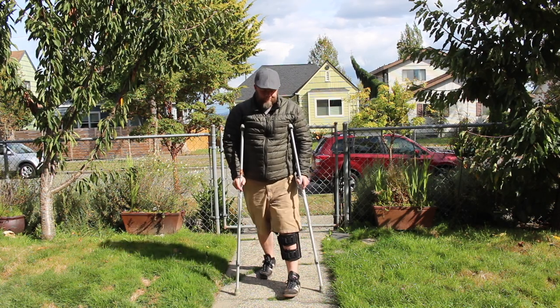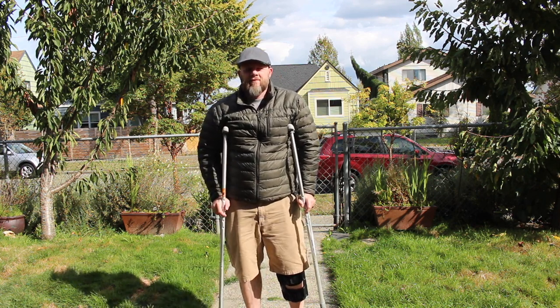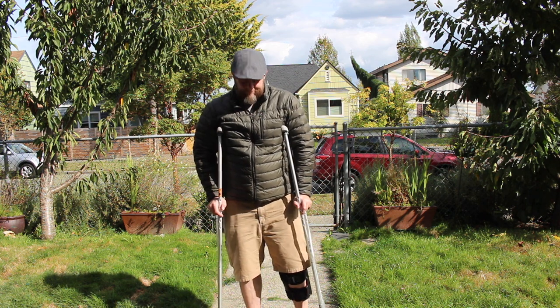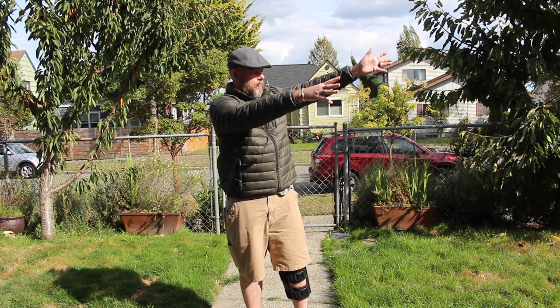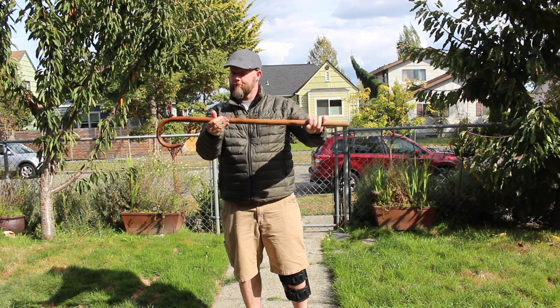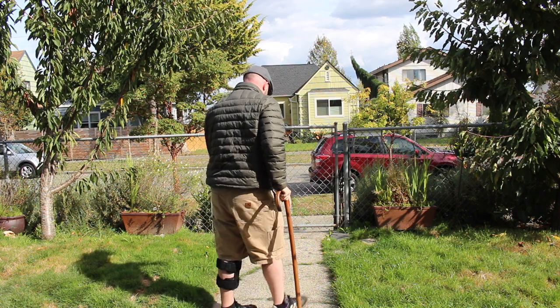We've all been there — either due to overconfidence, stupidity, or just sheer bad luck — and had to rock the crutches. At some point while wearing crutches, you're done with them and don't ever want to see them again. What you need now is a cane that will help you get through those pesky stairs and hobble on through until you completely heal.